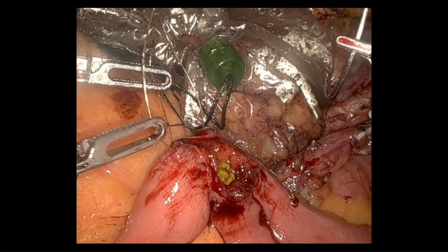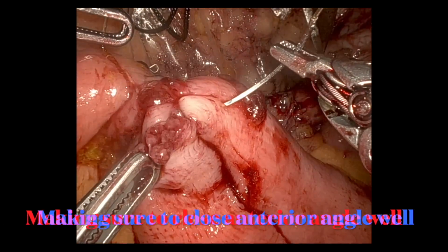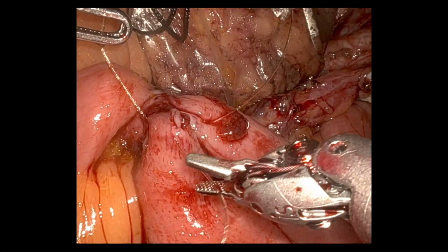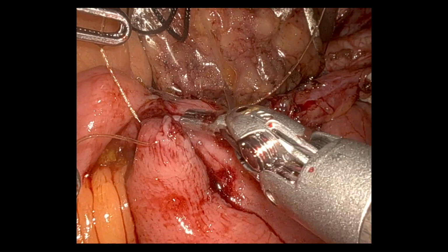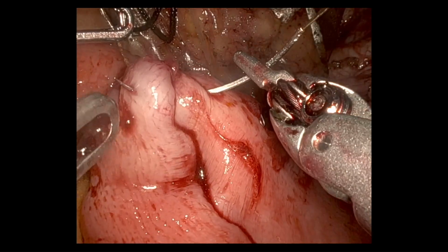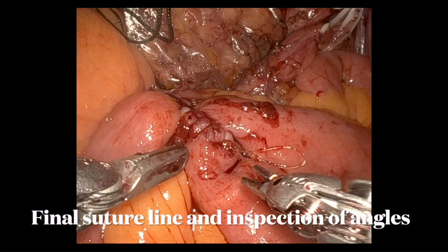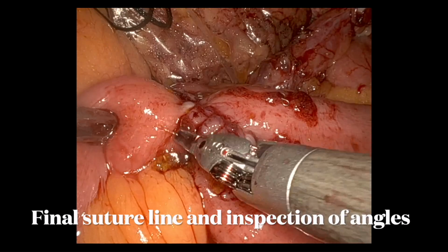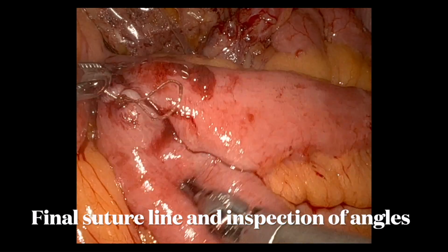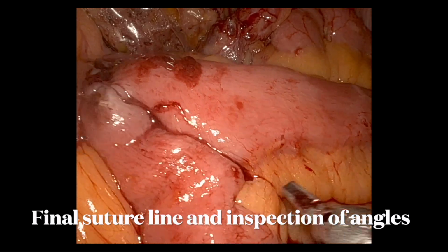Also, it is important to make sure that the anterior angle is closed very well. Once this is done, we tie the Stratafix at the end, and after this we inspect the anastomosis to see how the suture line looks and that the angles have been closed nicely.